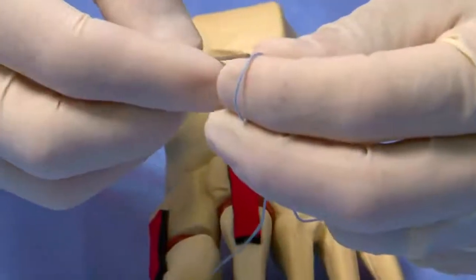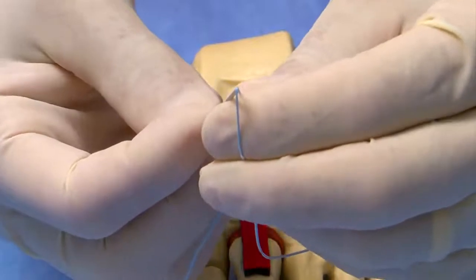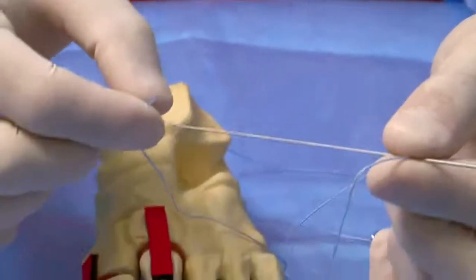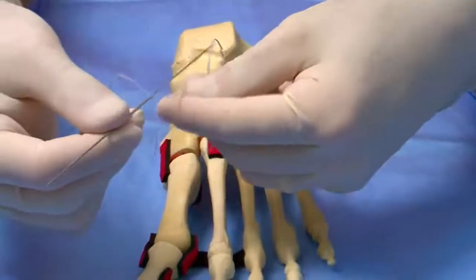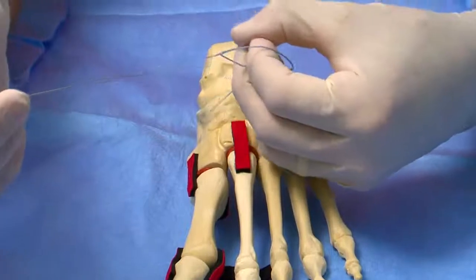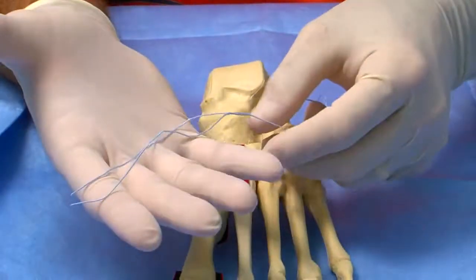and wrap it over one finger. You can take the guide wire that comes in the kit and pass it through the center of this tail. At this point, the other tail can be placed in the nitinol loop at the end of the guide wire. And pass through the original tail. You can see you are left with an X-type link of the original mini TightRope.